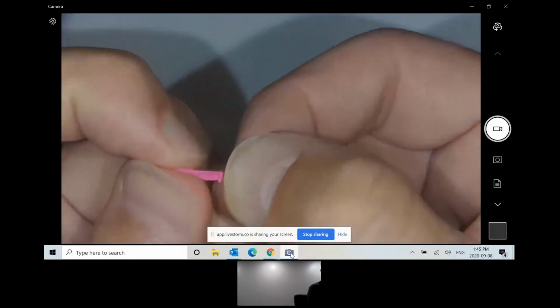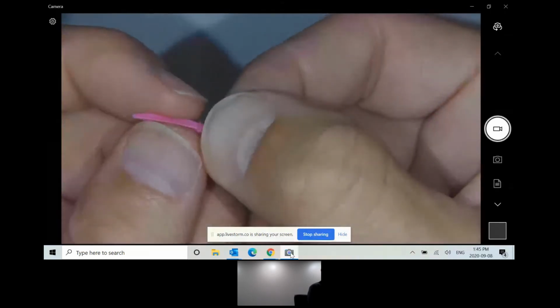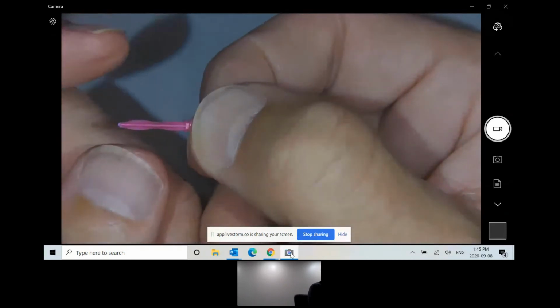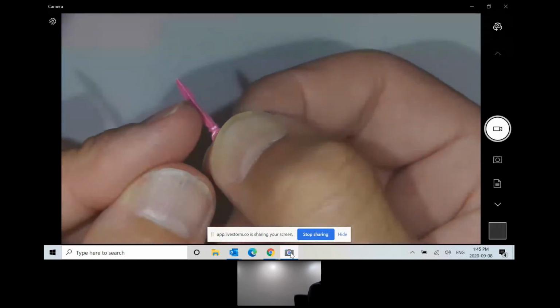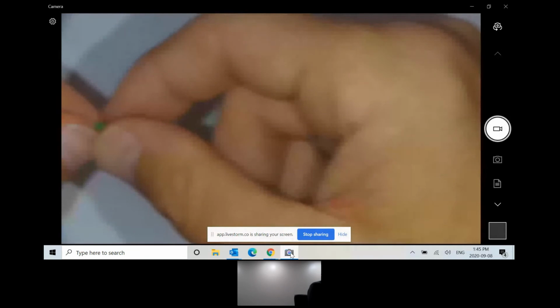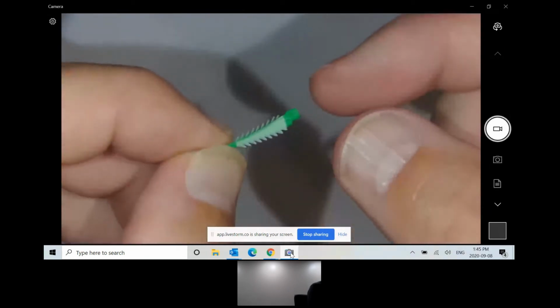This is the underside of the wedge. There's nothing there that's going to provide any separation force. It's a very, very smooth wedge, smooth plastic. So on occasion, this can back out of the embrasure area. And then the contour is not great, so it's not going to provide a really good seal on the lingual aspect of the restoration. So this was certainly to address the wedges from walking out.